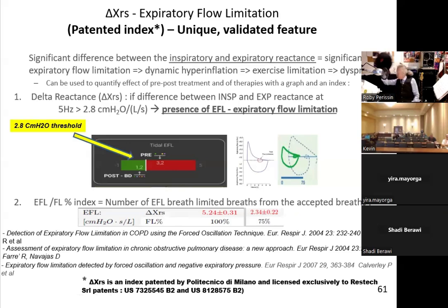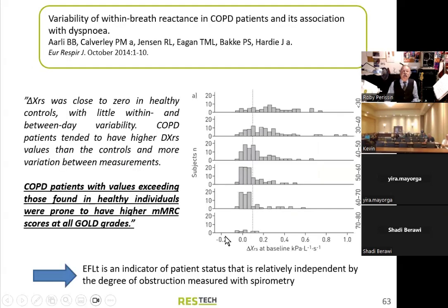Chapeau. So it is a percentage. 100%, the patient is completely flow limited. 75%, you have improved his functional capacity to an expiratory flow limitation of 25%. Fantastic. So you have a very important index that has been validated to actually show, even in patients not only with less than 30% FEV1, look how many of these patients have a flow limitation which is past the line.